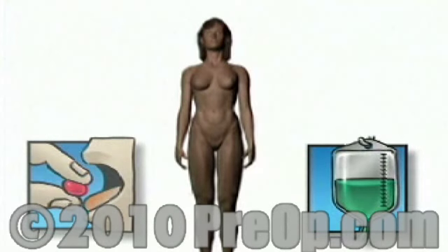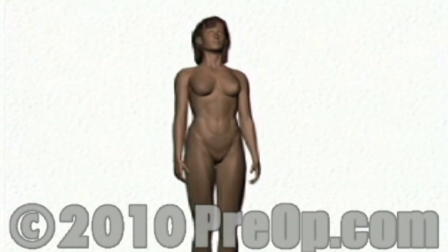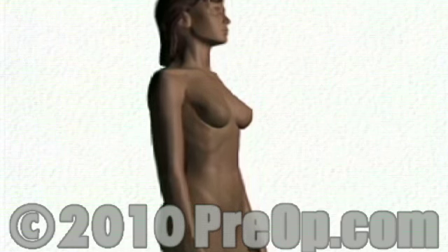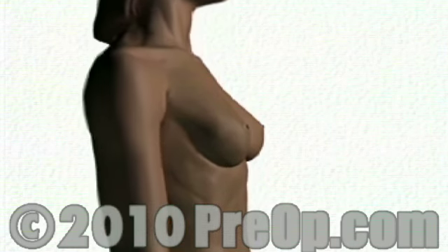On the day of your operation, you'll be asked to put on a surgical gown. You may receive a sedative by mouth and an intravenous line may be put in. Because the lump in your breast can only be detected through radiography, your surgeon will require assistance in locating the area in question. Before surgery, you'll be taken to a radiology lab.